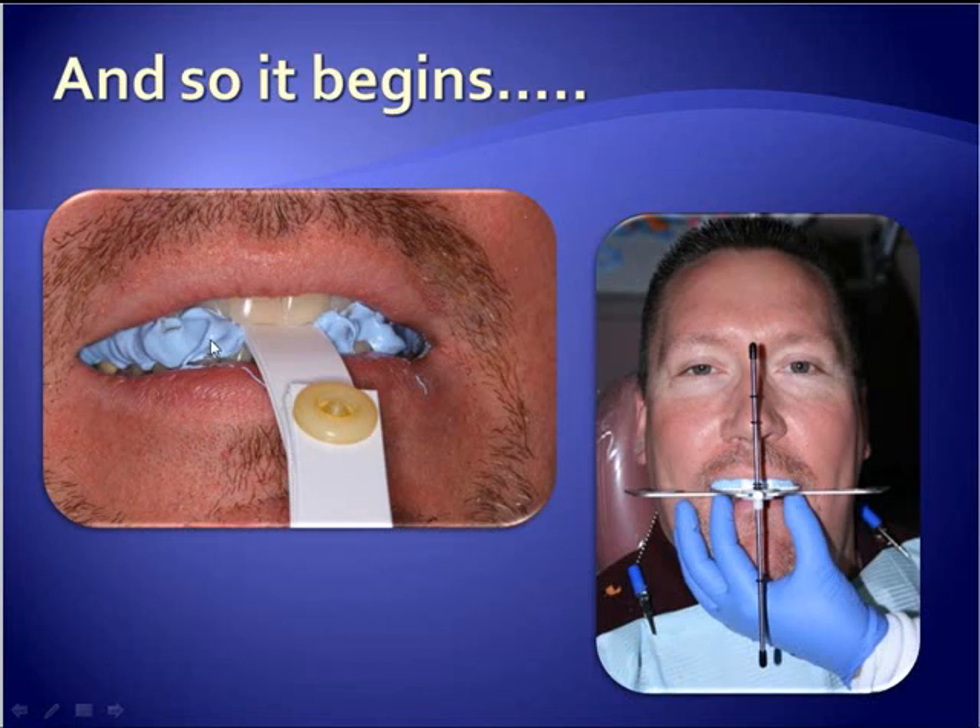I've also used Coltene Whaledent's JetBlue Bite. You capture it, and at the same time, using this reference guide — the Coise Dentofacial Analyzer that works with the Panadent Articulator — this is a good way to make sure your midline is on the money. So what's being sent to the laboratory along with impressions is this new bite registration and this midline reference so that they can wax up the case to the new vertical.